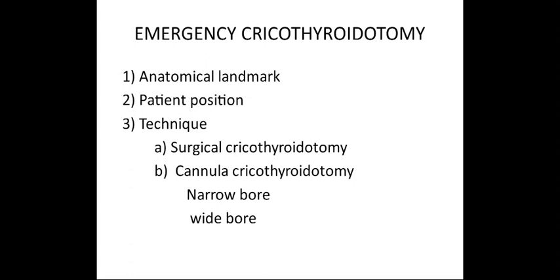Trocar devices carry risk of perforation of the trachea due to the force required to insert, leading to distortion of the trachea. Cricothyrotomy should be converted to tracheostomy at the earliest to avoid tracheal stenosis.